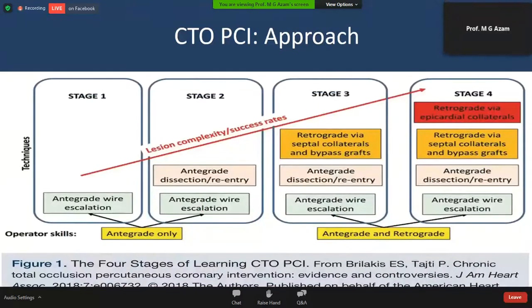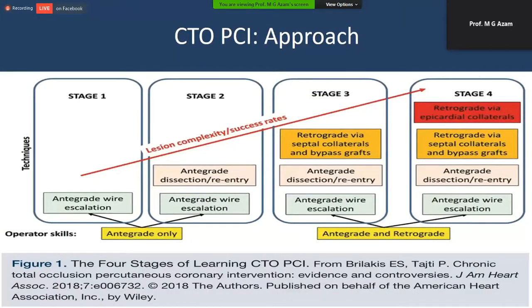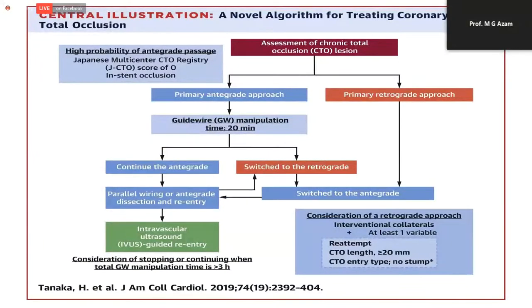There are several learning stages. As you know, at stage one we should go for antegrade, and the second time, antegrade, and the third time, antegrade. Then, as you learn, you go for antegrade dissection re-entry or retrograde approaches. So I think we should prefer antegrade first, then go for antegrade dissection re-entry or retrograde. Anyway, this is the simplified algorithm. If you consider the primary antegrade approach, you should manipulate your guidewire for at least 20 minutes. If it is not successful, then you can use the parallel wire technique, or intravascular ultrasound can be used for re-entry.